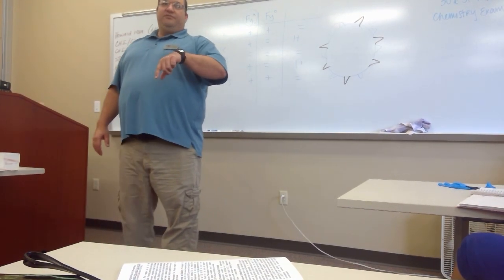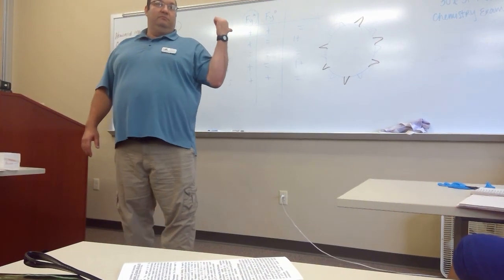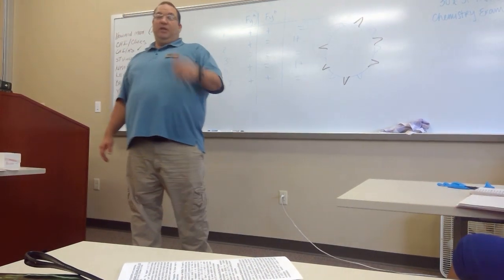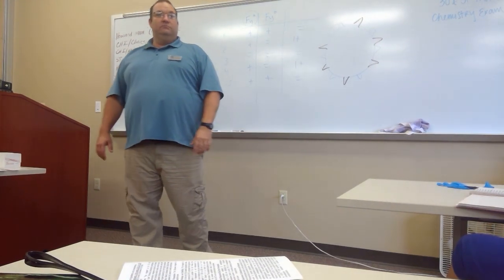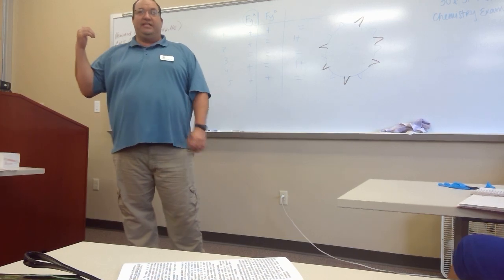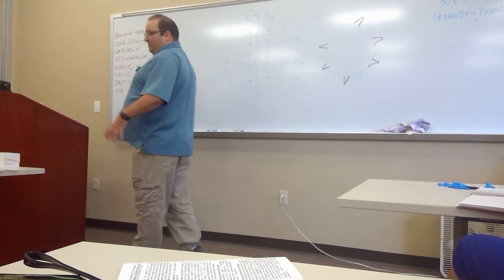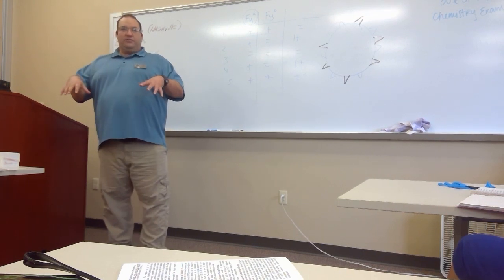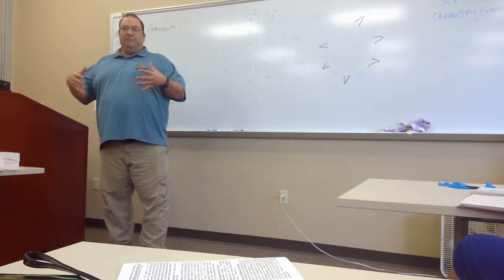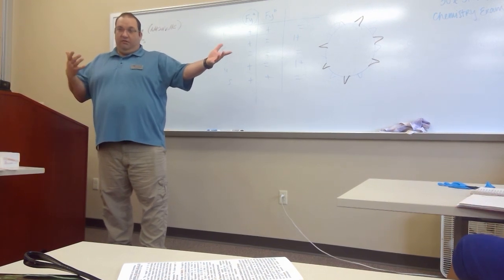And when they don't have a history and I think they got an antibody, I would always call St. Joe, because sometimes they would have history. They've probably been there. And hey, the blood bankers over there would call me too: hey, you have a history on John Doe? Well, let me look. So use your resources. They got a big seat. Especially if they're a local person, they got that antibody somewhere. If we don't have a history on them, maybe they got it across town, so call them.